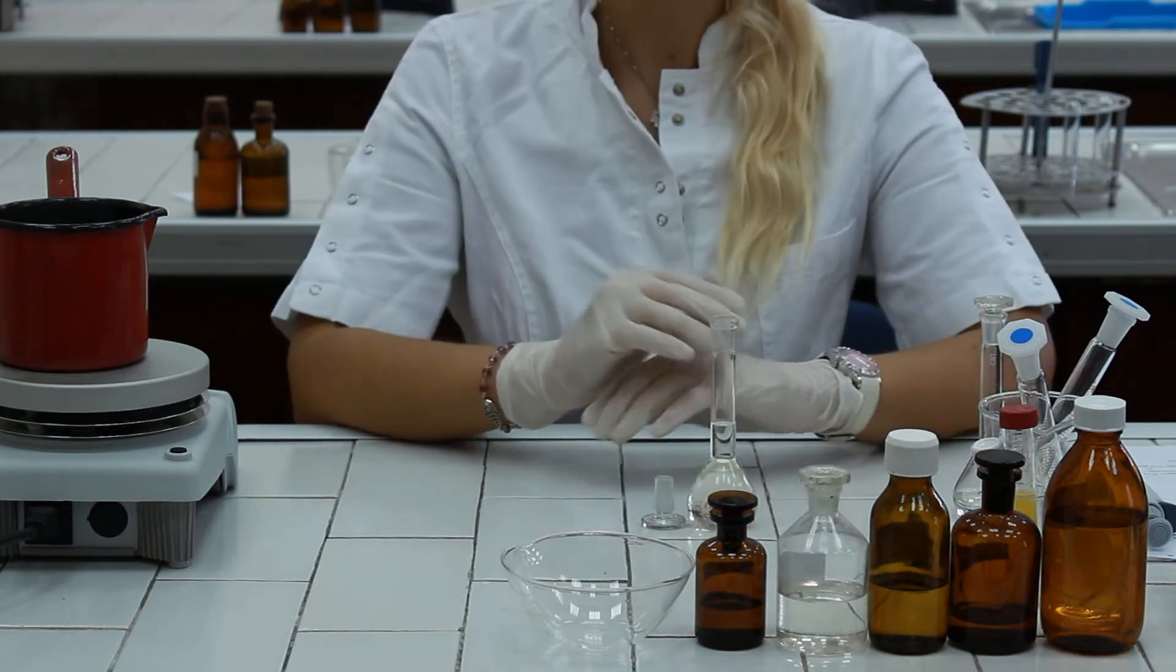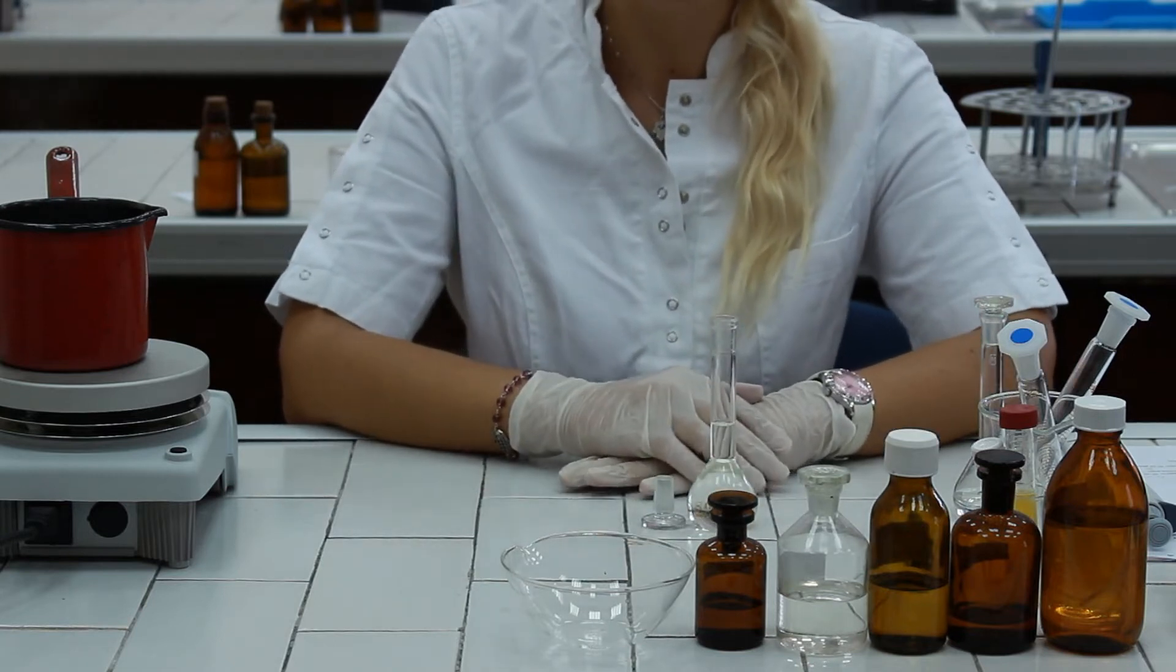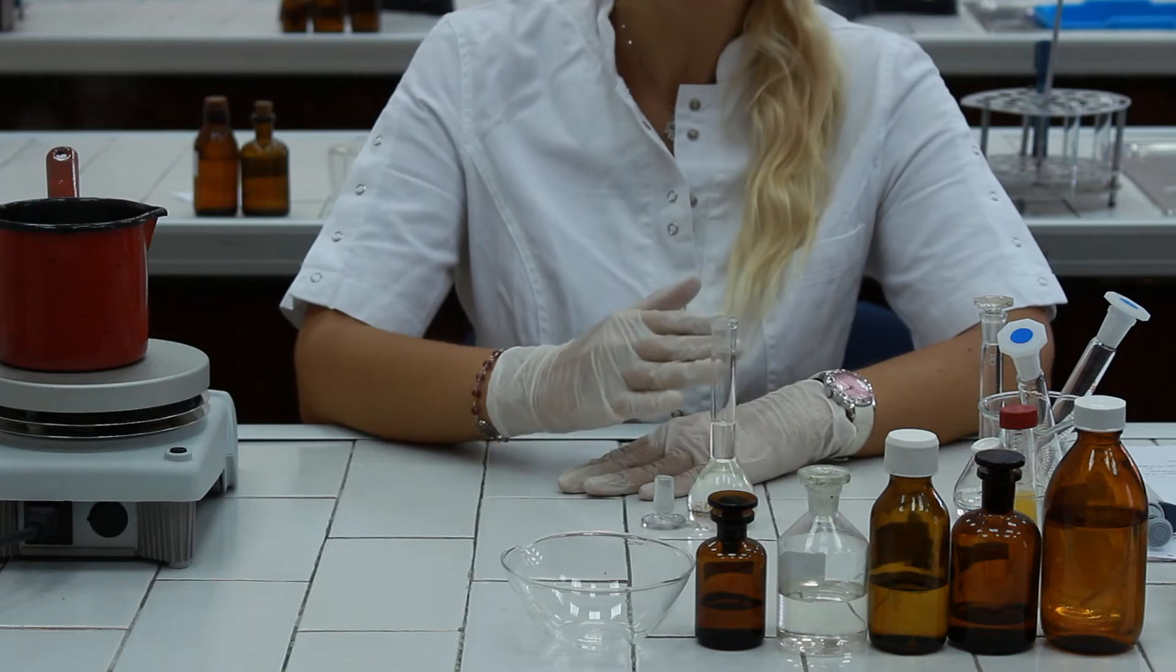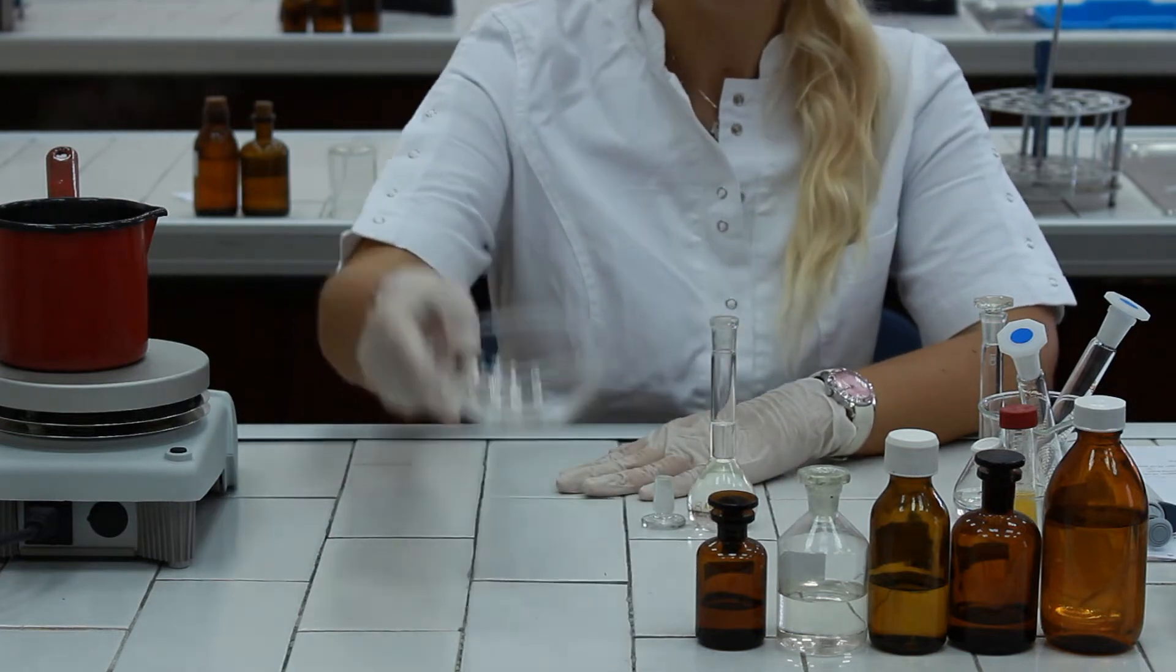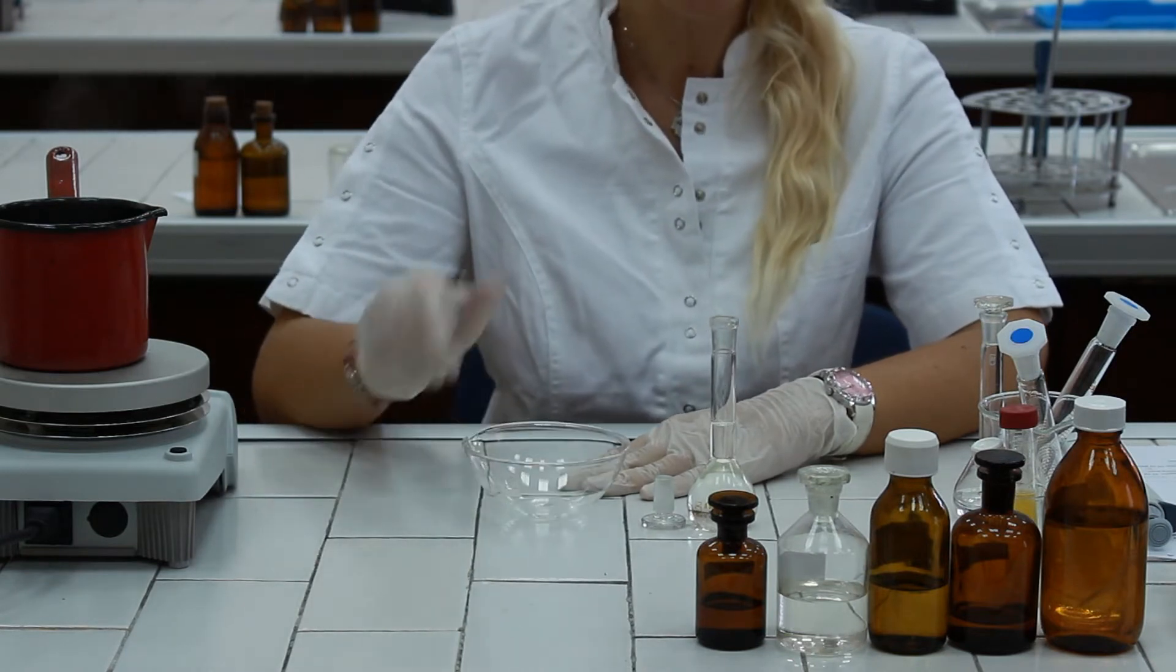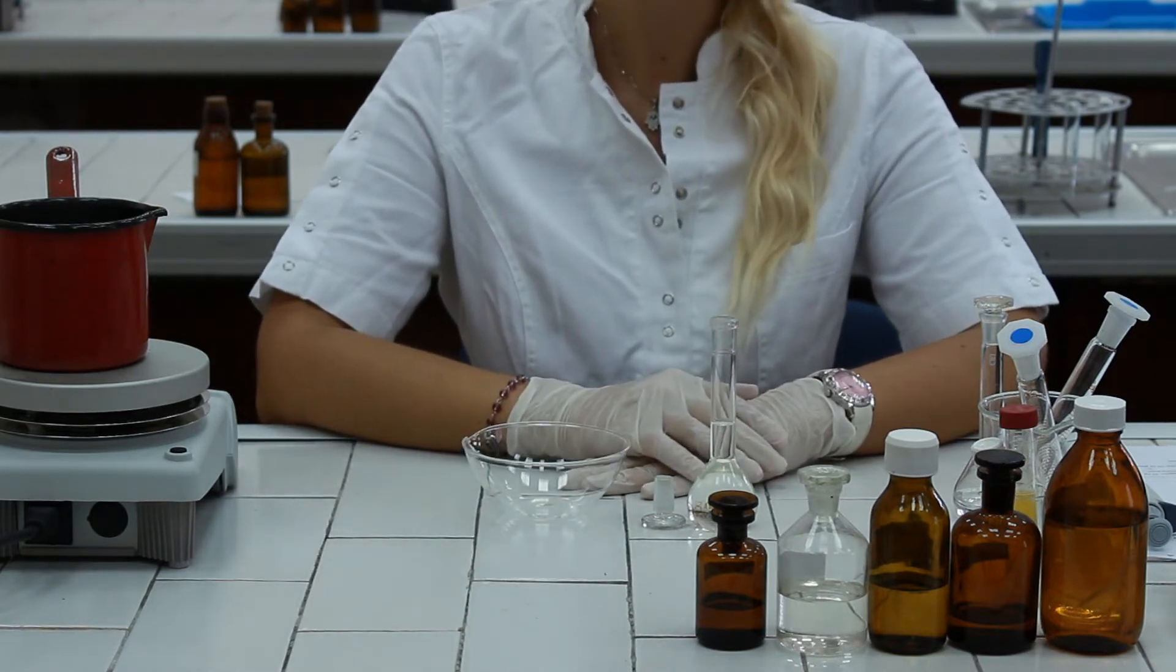Now we have to prepare the chloroform solution of our cholesterol, so first we have to remove ether and ethanol from the mixture. In order to do that we are going to take an evaporating dish and pipette the aliquot of 10 milliliters of ether-ethanol solution of cholesterol.